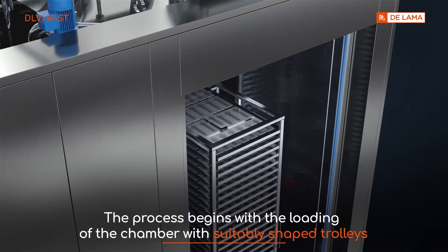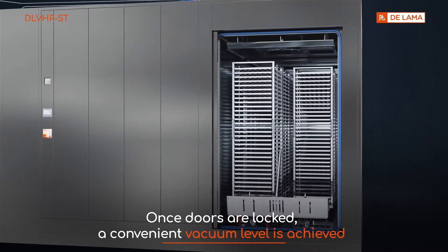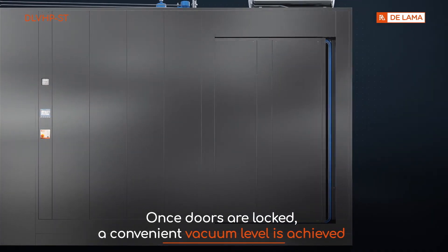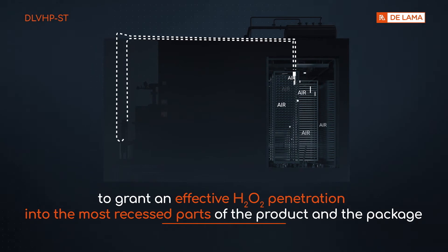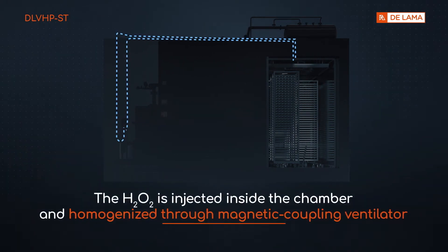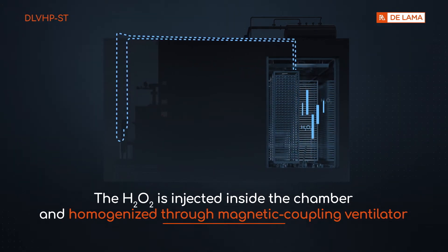The process begins with the loading of the chamber with suitably shaped trolleys. Once doors are locked, a convenient vacuum level is achieved to grant effective H2O2 penetration into the most recessed parts of the product and the package. The H2O2 is then injected inside the chamber and homogenized through a magnetic coupling ventilator.